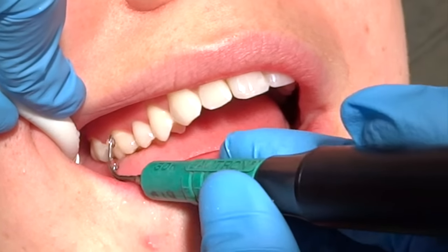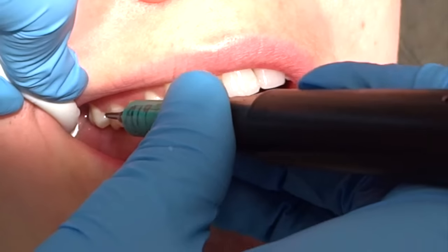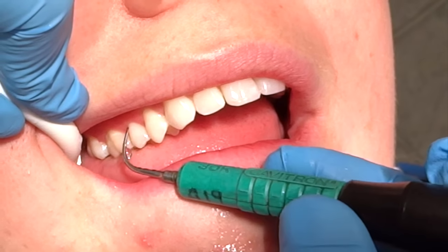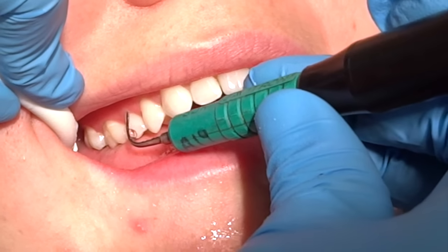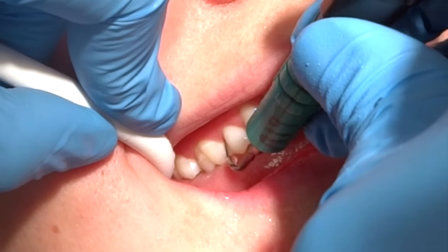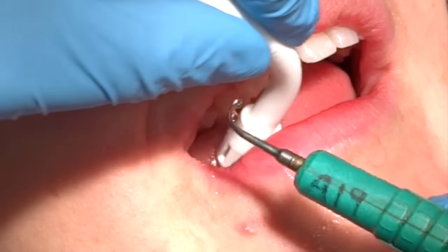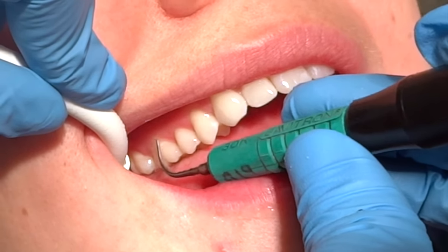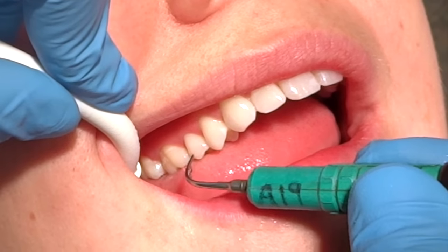You do not want to do this — this is something I see often. If you come from the mesial like this, this is not as effective. You want to be down like this on the lateral side, not the back of the instrument. I also see this a lot — coming to the distal, you're on the face of the instrument, and you're not being as effective. Even better: twist it and go to the other side. Remember your multi-directional strokes — up and down, side to side — making sure that you are being thorough in your calculus removal.